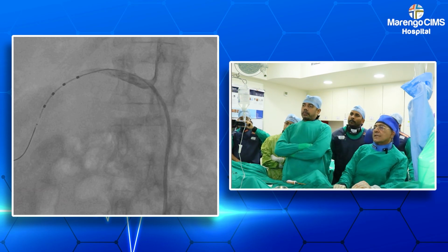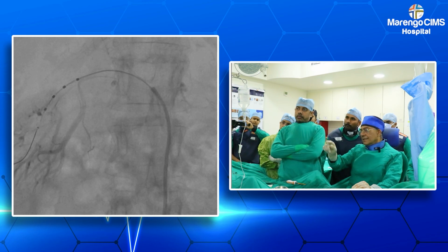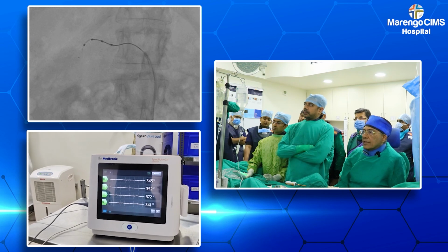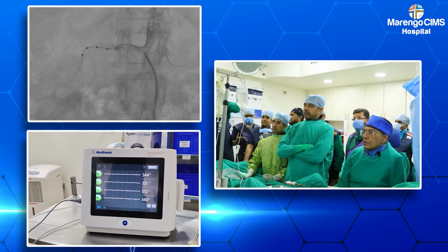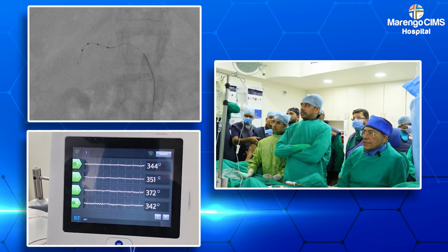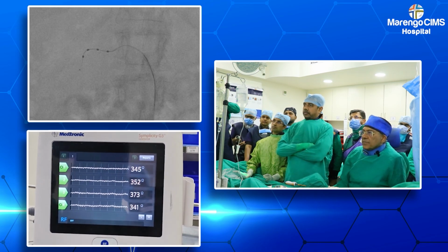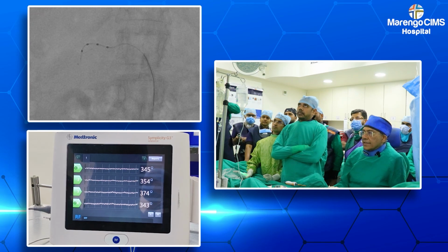So we are reasonably inside the kidney, right? Seen on the fluoroscopic view, we have properly placed the 4 electrodes in the spiral catheter, with the distalmost electrode proximal to the renal cortex, and the second electrode facing the contralateral side of the inferior branch of the renal artery. The third and the fourth proximal electrodes are in the main renal artery.